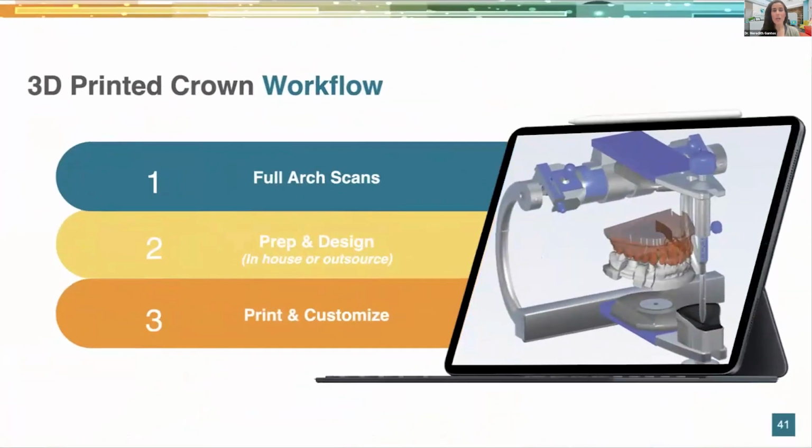So I talk with Renee and we decide to stage this case out. What we're going to do is our 3D printed crowns first, and then we're going to stage it out. Each year she can convert one of those to a porcelain ceramic crown, right? And so we're going to ride this case out a little bit longer.